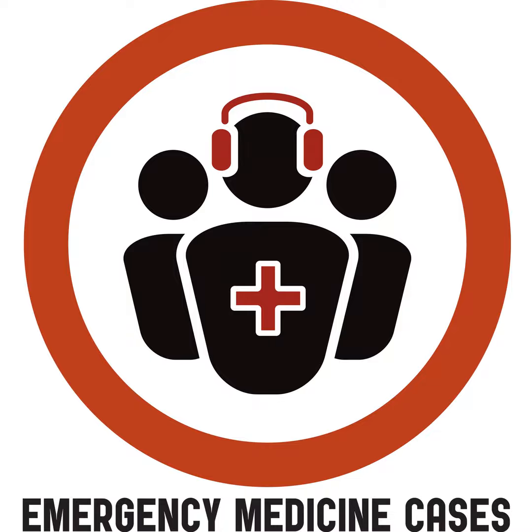I love what Dr. Sayal just said. And in my opinion, even elective knee ultrasound, I'll be direct when I say this, is one of the more overhyped things, because often when I'm reading at the clinic, many knee x-rays are accompanied by an ultrasound and it's just not adding enough value. You can miss meniscal tears. And if somebody has advanced osteoarthritis, you're probably going to have a meniscal tear. That doesn't matter. You can't directly evaluate the cruciate ligaments with knee ultrasound.